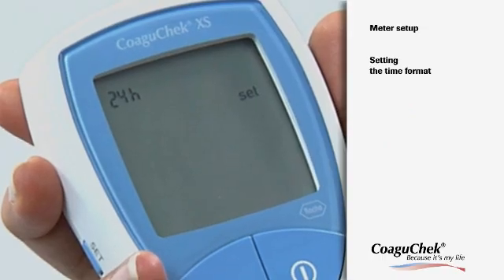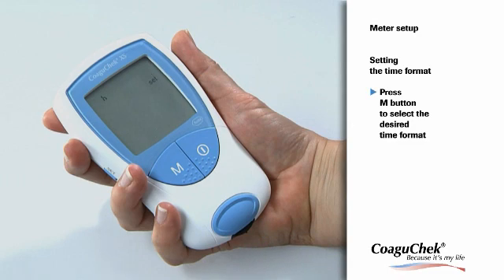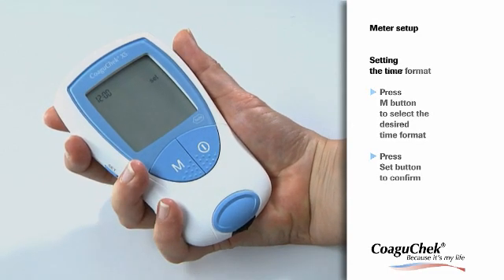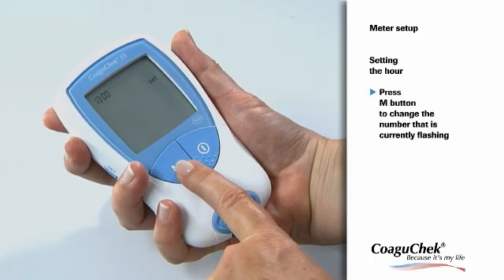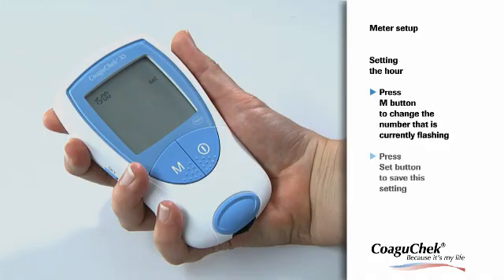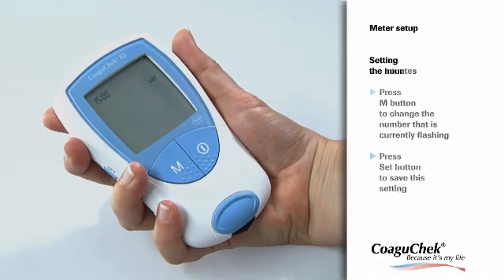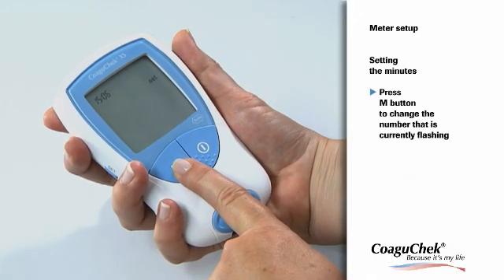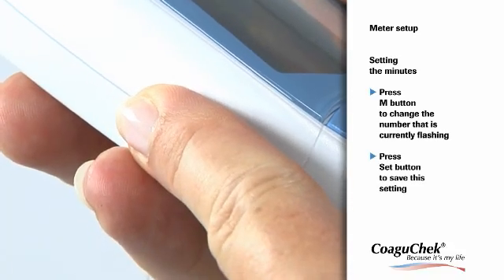The display now changes automatically to the time format setting. Press the Set button to confirm the desired format. The display then changes to the time setting. First press the M button to change the hours and save your setting. Then repeat the last steps to adjust the correct minutes, and finally press the Set button to save the new time settings.